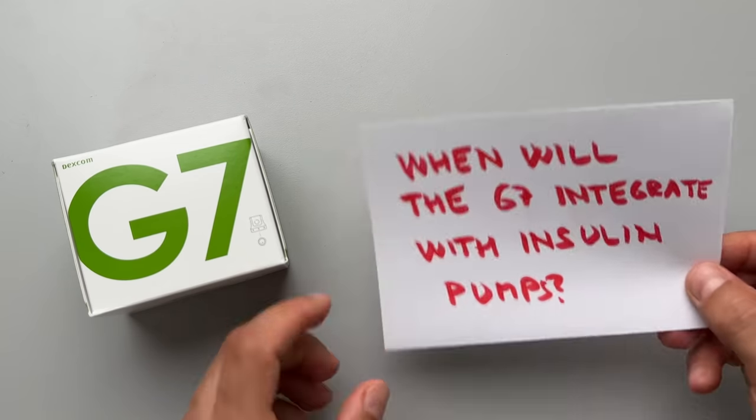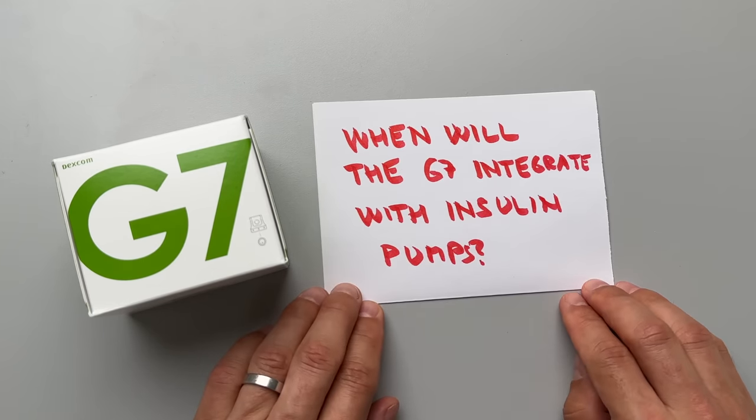Secret number 1: when will Dexcom G7 integrate with insulin pumps? As of July 2023, you can only integrate with DIY loop solutions — no commercial pumps yet. Tandem and Insulet are working on integration of their Control IQ and Omnipod 5 systems with the G7, expected in the second half of 2023 for Tandem and early 2024 for Insulet, though that's not guaranteed. If you want to get the most out of your Dexcom G7, check out my detailed G7 sensor review video.